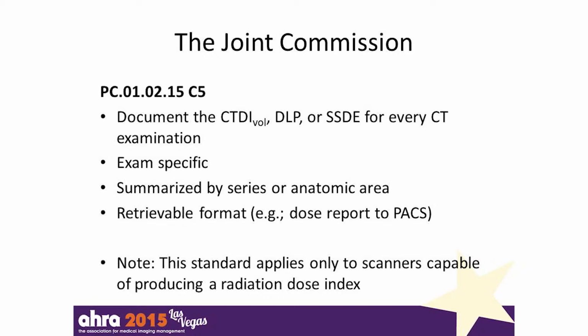The first requirement is a requirement to document the radiation dose index. That's either the CTDI, DLP, or SSDE, size-specific dose estimate, for every CT examination. This must be exam-specific, summarized by series or anatomic region, and be in a retrievable format. One note is that this standard only applies to scanners capable of producing the radiation dose index. I'll come back to that with a later requirement.